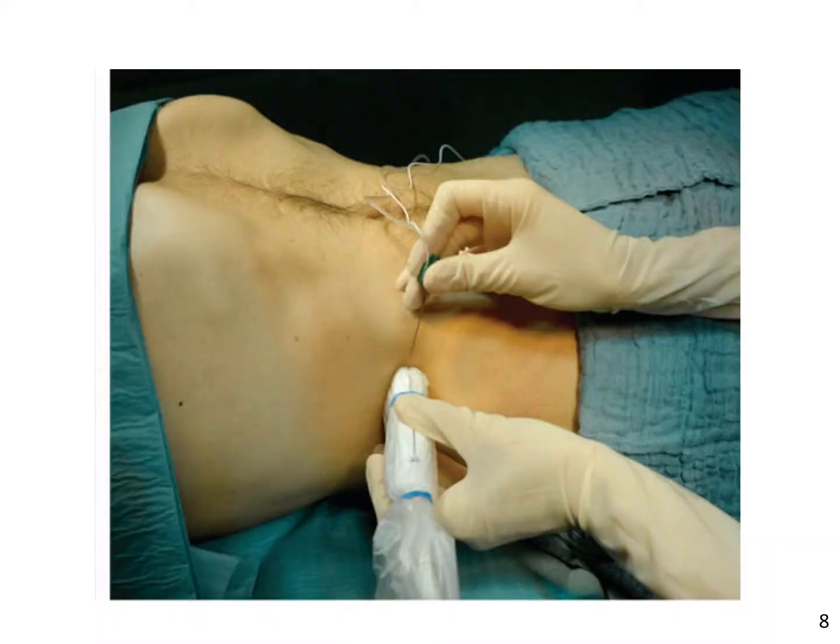Once the anatomy is identified, you can set up to perform the block. Also make sure that during your anatomic scan, you are looking for blood vessels that could lie in the trajectory of your needle path. There are a few different approaches to inserting the needle that are described in the anesthesia literature. Probably the most straightforward approach is the medial approach, which is shown here. The needle is inserted near the medial edge of the probe and advanced using an in-plane technique.